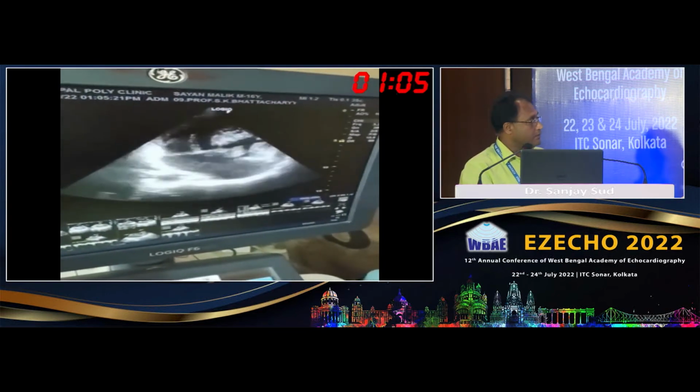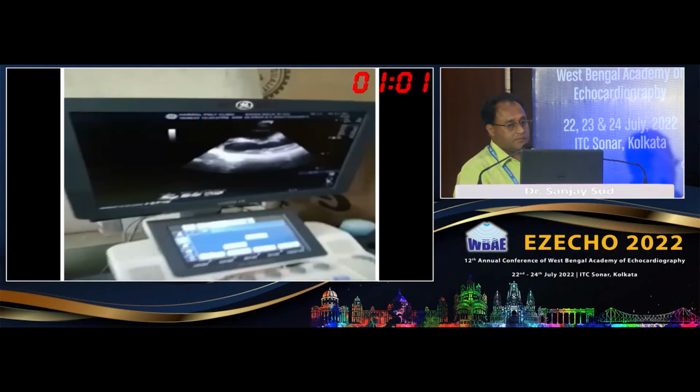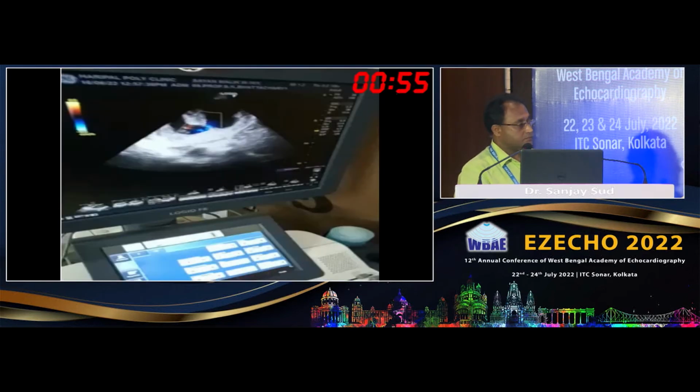Because what we find is a congenital cyanotic heart disease with decreased PBF and situs inversus. Now in this setup, it could be two things, either the tetralogy of Fallot or a physiologically corrected transposition of the great vessels with VSD and PS. The VSD is not classical of Fallot here, though the pictures are not good. It is involving the inlet as well as the other portions.